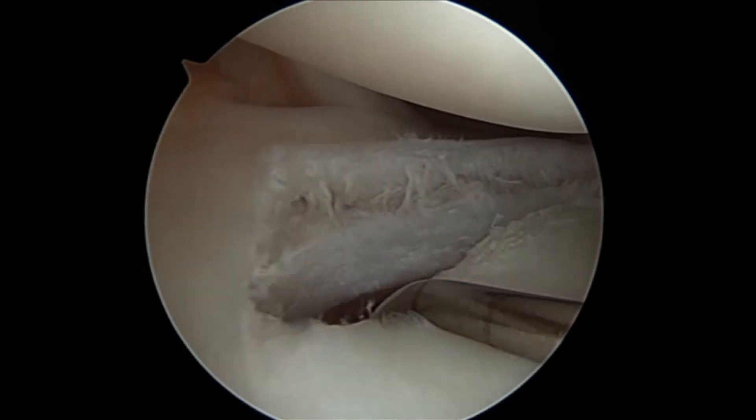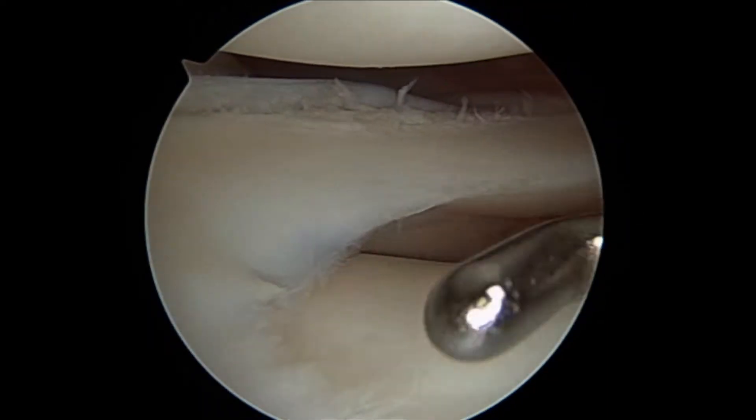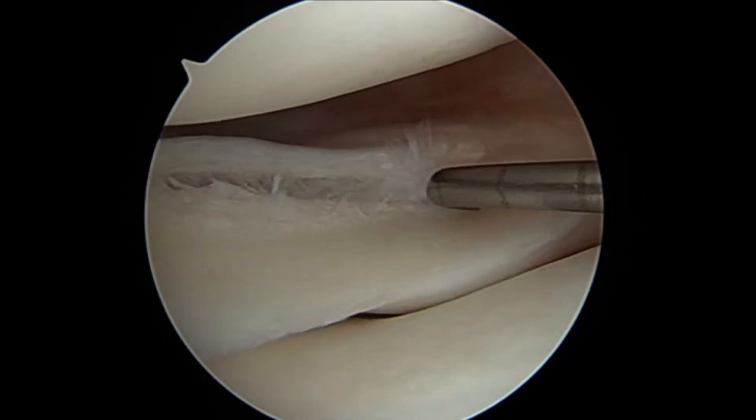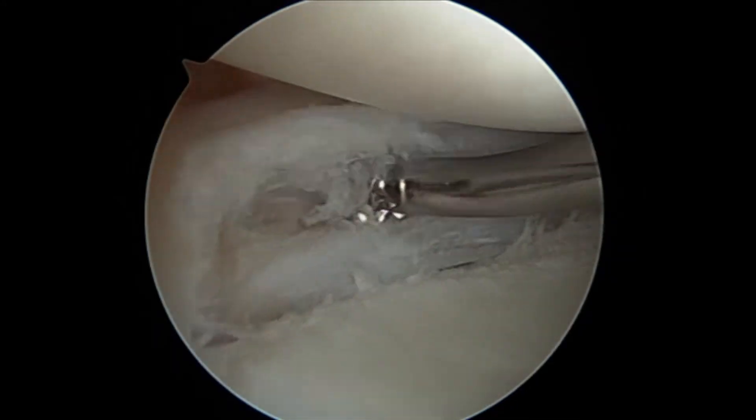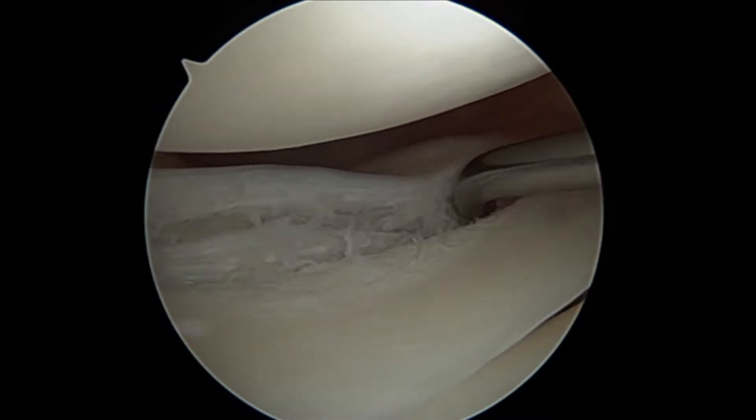Here we are at arthroscopy. The first thing we'll do is outline the anatomy of the tear. We can see that it has longitudinal and horizontal components. Then we're going to debride some of the scar tissue to help restart the healing process.